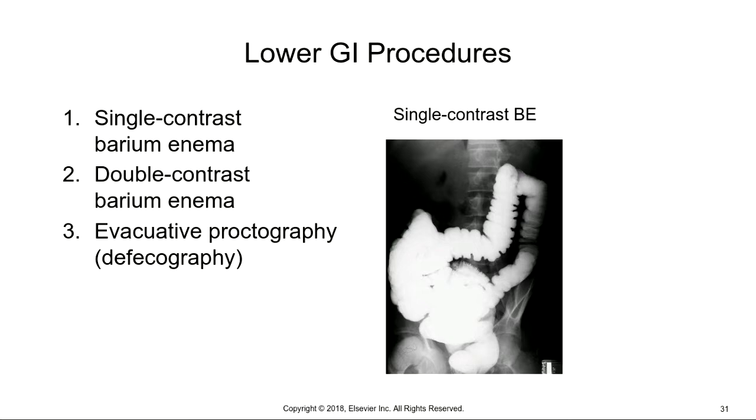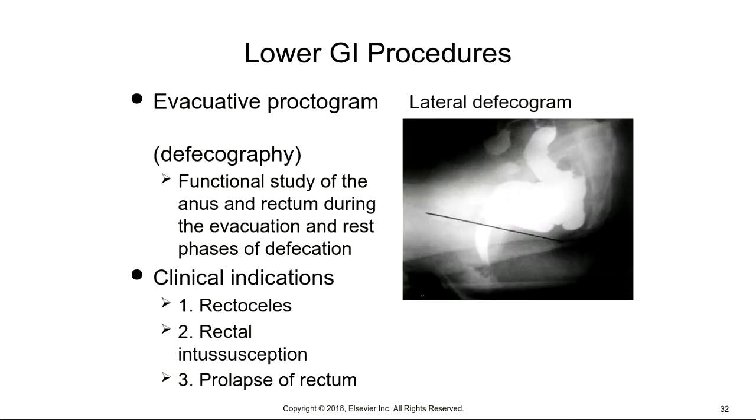The next exam we're going to talk about, so we've talked about a single, we've talked about the double. Now we're going to talk about evacuative proctography, or sometimes it's referred to as defecography. That's a mouthful. If you turn back to page 508, this is in your book, okay? Evacuative proctography, or an evacuative proctogram, or they'll call it a defecogram.